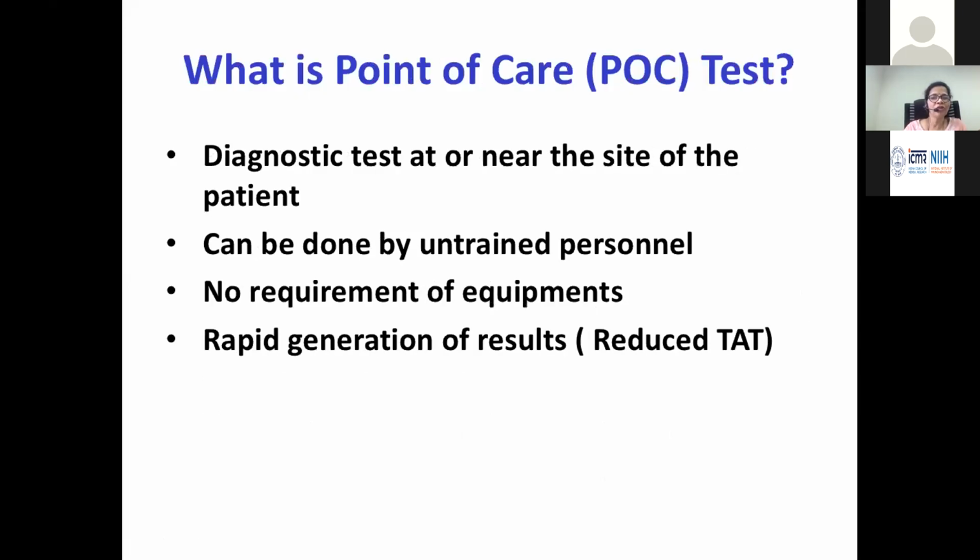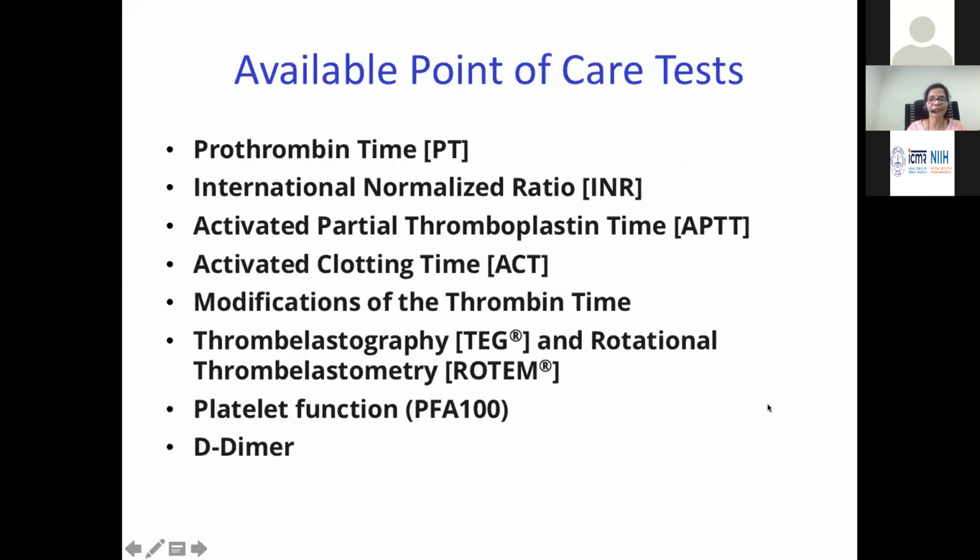Now, what is a point of care test? It's a diagnostic test at or near the site of the patient. It can be done by even untrained personnel. There's no requirement of expensive equipment, and it has rapid turnaround time, with rapid generation of the results.